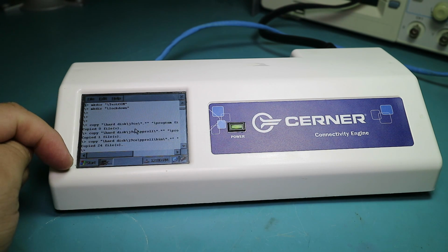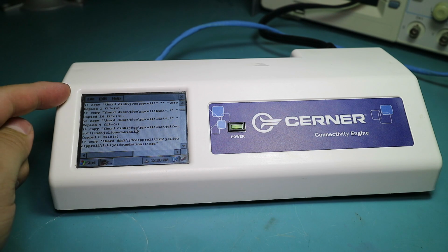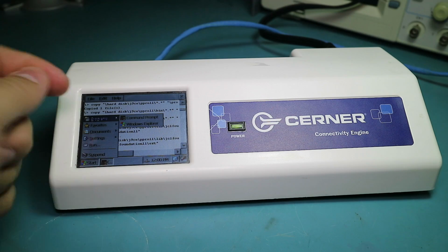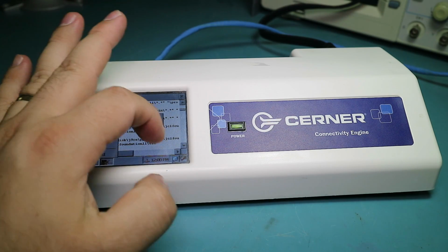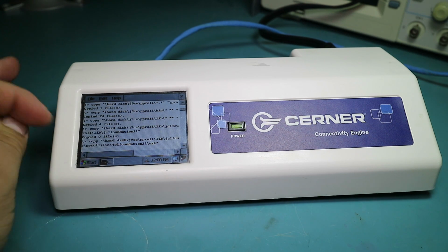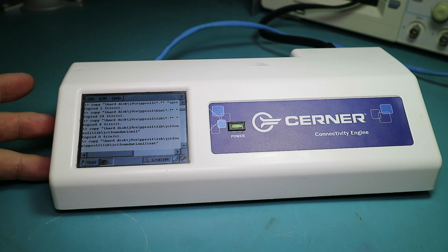and you can see when it boots up, it actually loads Windows CE and then runs a couple batch files, and you can actually start doing stuff with this thing. It's got a touch screen, but it will run a little batch file, and then it will eventually load its touch interface software, which from what I can tell doesn't actually let you do anything with. Once it kicks on, it basically just sits there showing you the IP address.